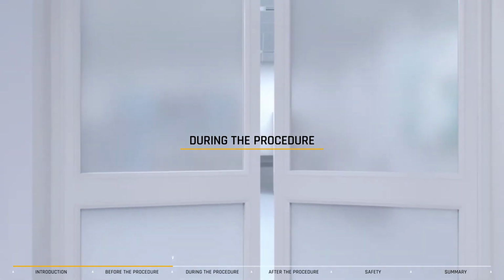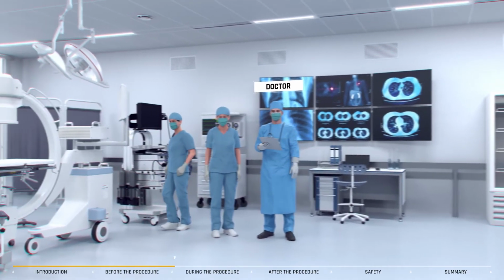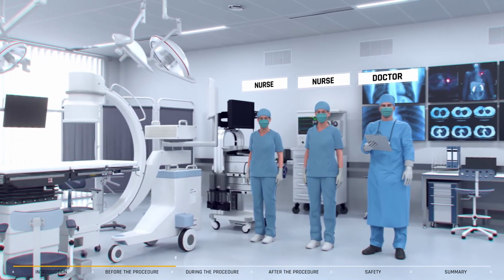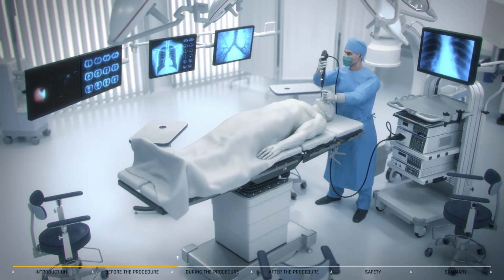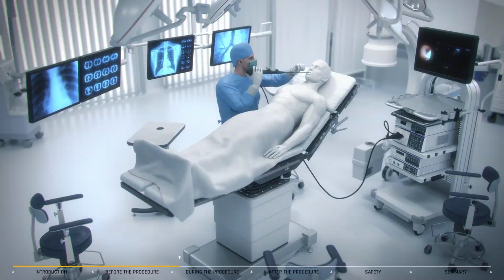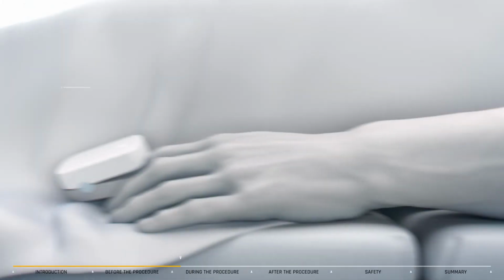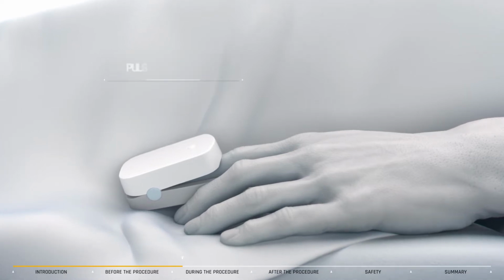In the room where the procedure will take place, there will be a doctor who will perform the procedure and at least 2 nurses to support. The procedure can be performed with you laying down and your doctor standing behind your head, or sitting upright with your doctor facing you. The nurses will attach a blood pressure cuff and clip on your finger, which does not hurt, to measure your oxygen levels.